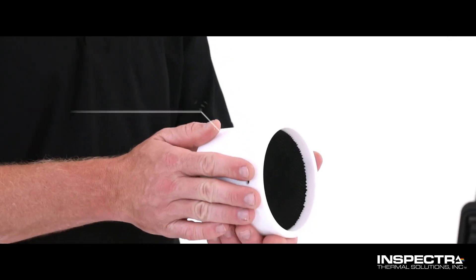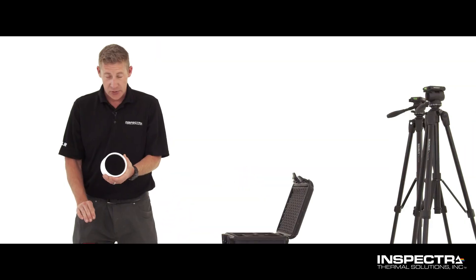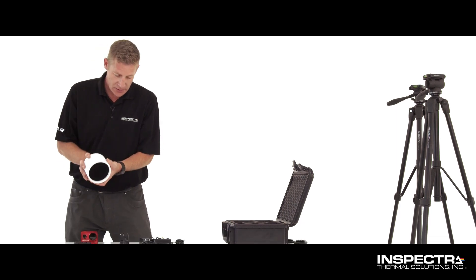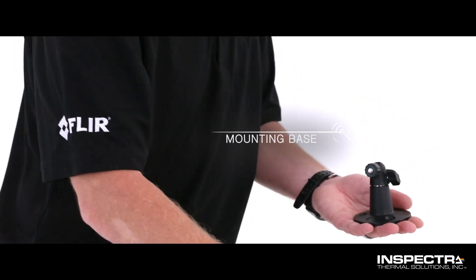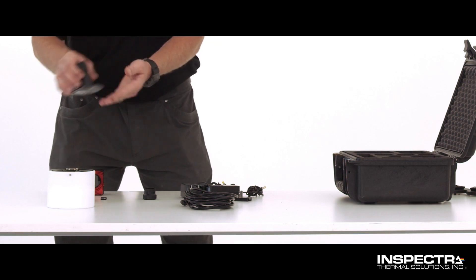This is the temperature control module. This will dictate the temperature control baseline for the camera, so we always have a very accurate temperature. We do have a permanent mounting base that you can use for the temperature control module. You can also use a tripod if you like.